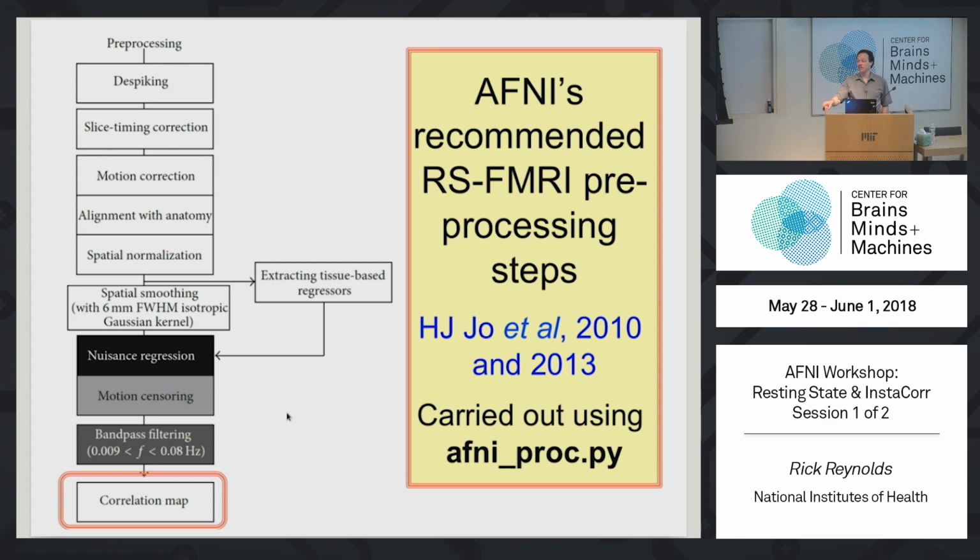Can you say a little bit more about tissue-based regression? We'll hit a few things, but basically the one thing we try to avoid is anything with BOLD in it. If you regress out BOLD signal, you might think to some degree no big deal, because you're losing a little of what you might care about, but then you just won't get that in your results. It's actually much uglier than that.